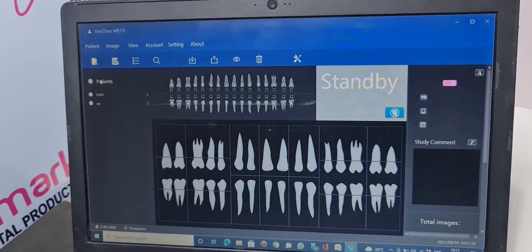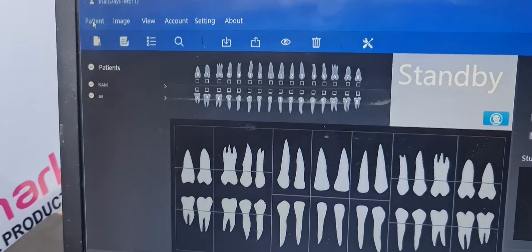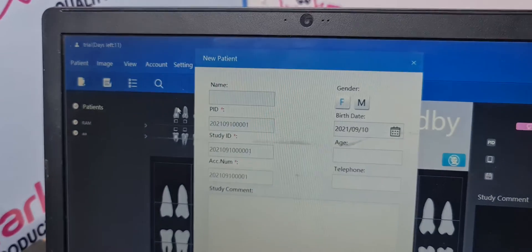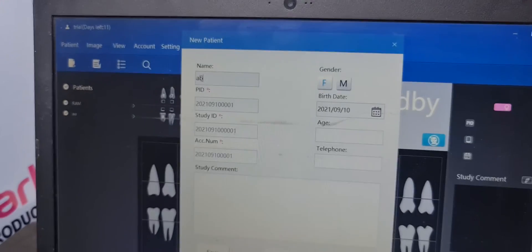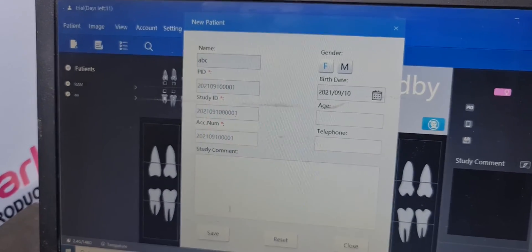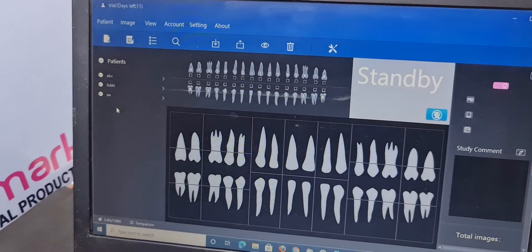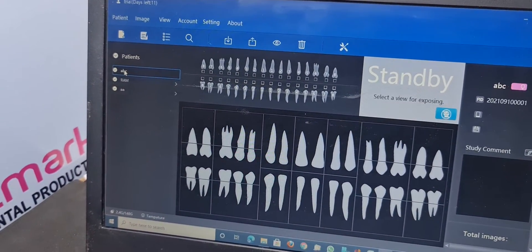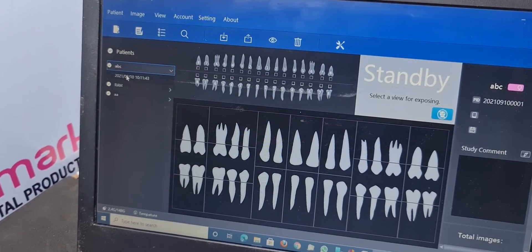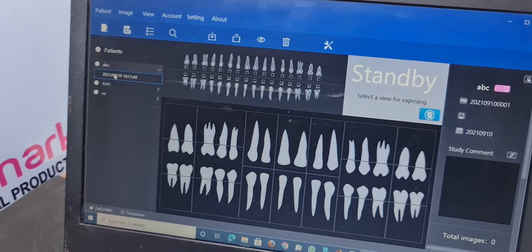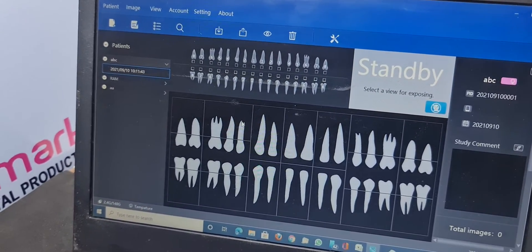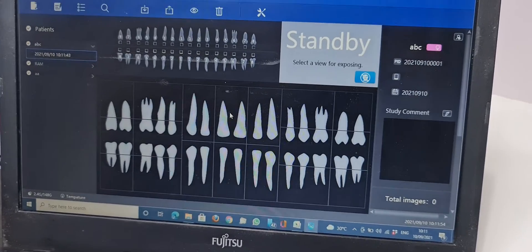After this, now if you want to add new patient, new patient, write ABC, any name, male, female and save. So the patient is created here. Click and the file is here. When you click this lower file, now your sensor is ready to use.